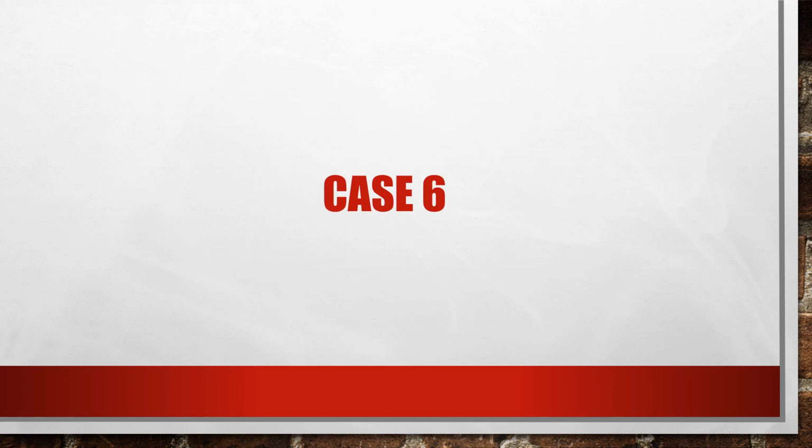So that patient underwent surgery and they replaced the valve. So let's talk about case 6.